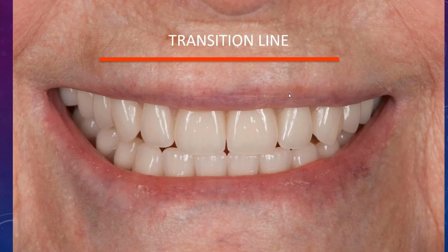Personally, if it was me getting this done, I would probably go with an overdenture versus a hybrid for a couple of different reasons. Major one for me would be hygiene. Hybrids are notorious for being problematic when it comes to cleaning. With overdentures, it's generally not an issue because you can remove it yourself, you can properly clean them, and get them put back. Also, when it comes to repairs, overdentures are a lot easier to deal with because you don't have to unscrew the whole thing, right?